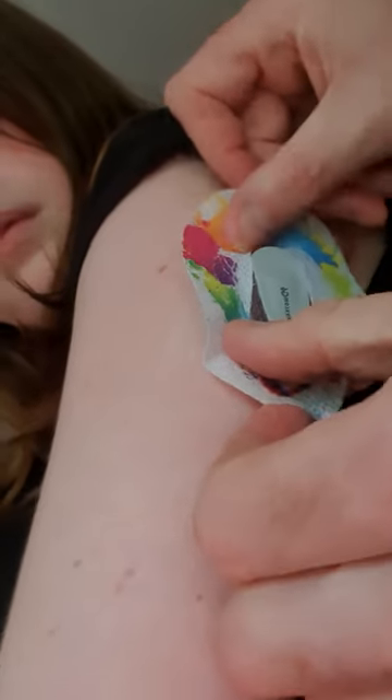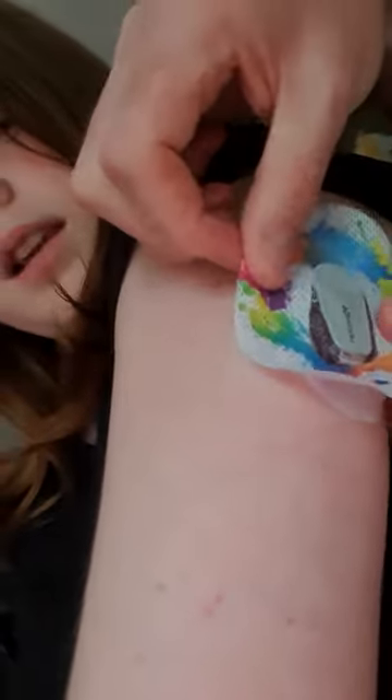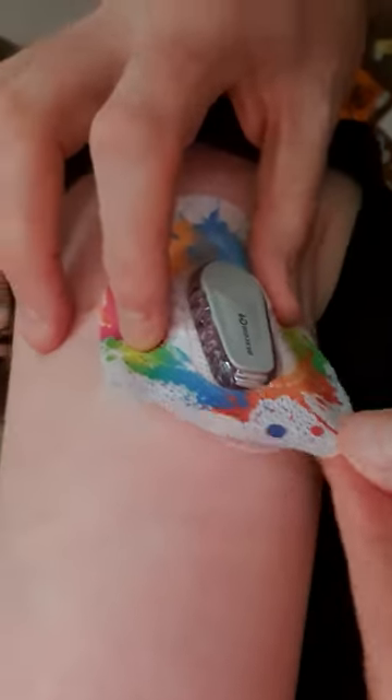This is how you put it on — just put it around the arm. Does not matter if it's a bit creased, everything gets creased a bit. And abracadabra, then you will be able to go. Thank you. Bye.